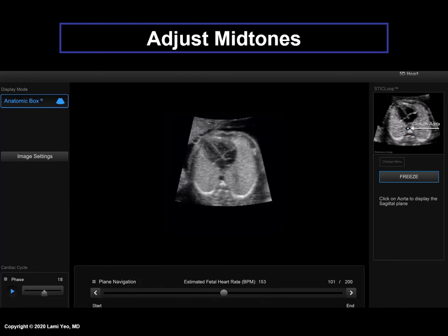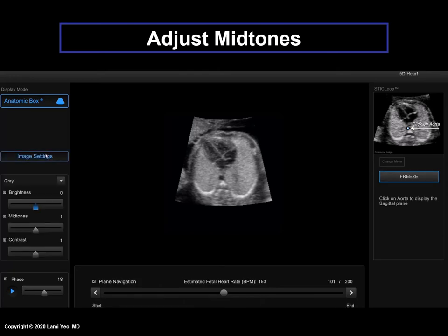Here is another example. By increasing the midtones, the image — which is the four-chamber view — shows darkening of the medium neutral grays. The image overall appears more optimal.